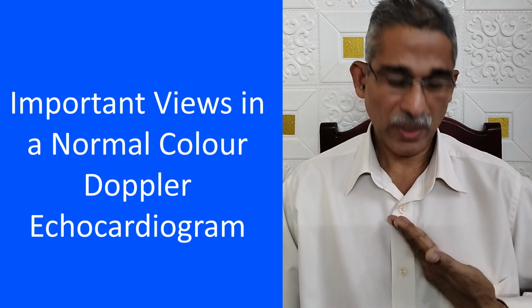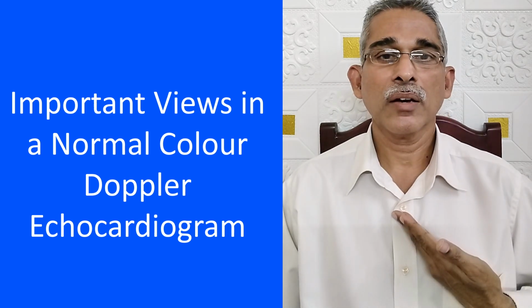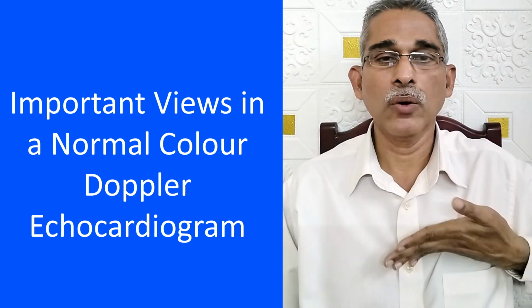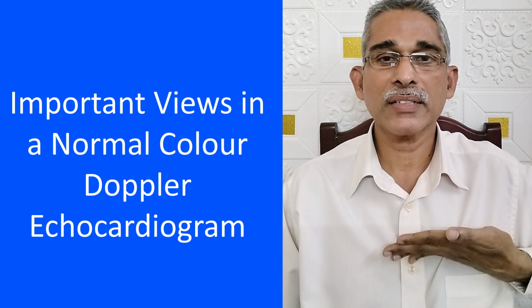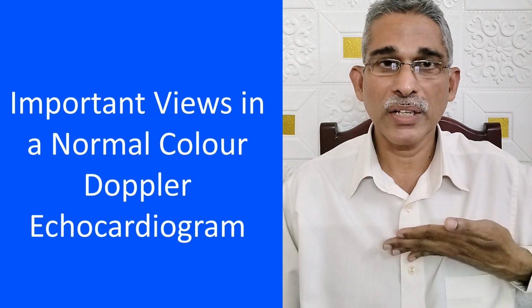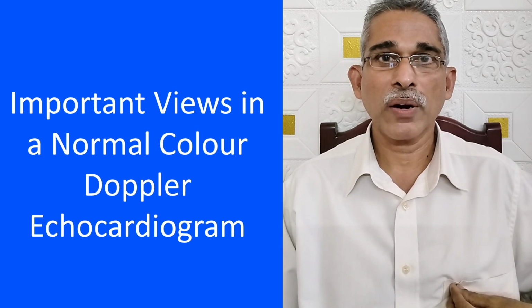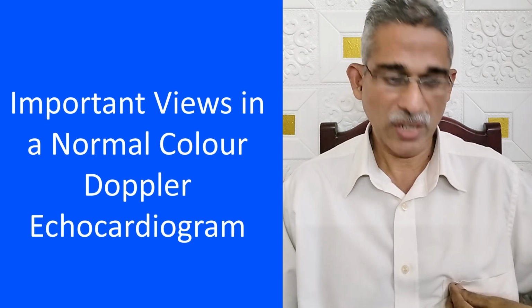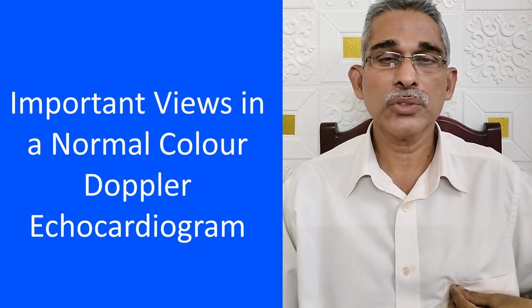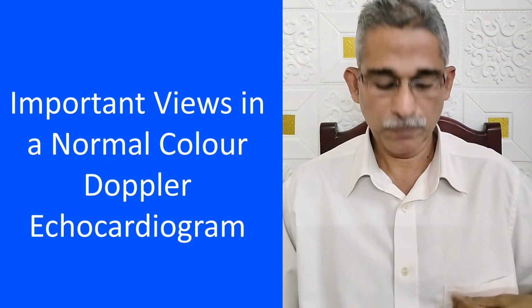For example, this is the parasternal long axis view. It goes from the base of the heart to the apex. And if you place it the other way around, this becomes the parasternal short axis view. These are the two commonly employed views initially. Then from the apex, you can have a sweep from the apex to the base of the heart, and this can also be multiple views: 4-chamber view, 2-chamber view, and 3-chamber view. Those can be obtained from the apex.